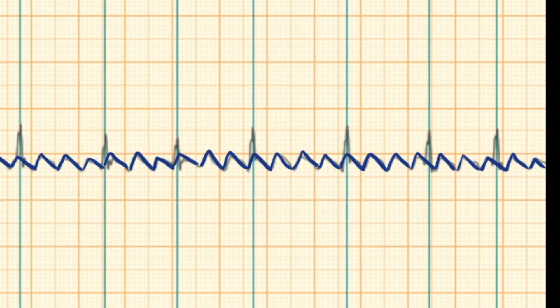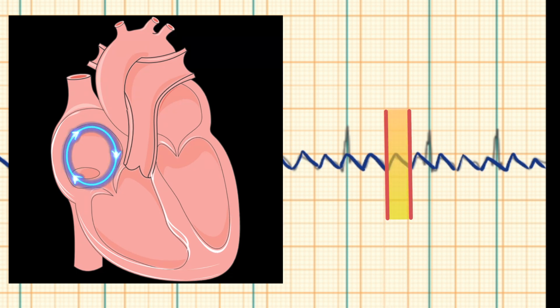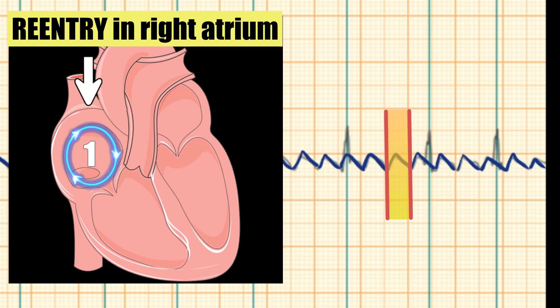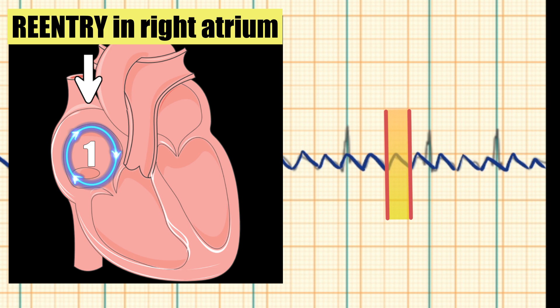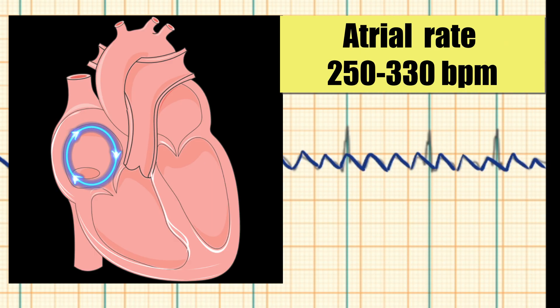Atrial flutter is a macro reentrant atrial tachycardia. Every sawtooth wave indicates one reentry circle inside the right atrium. Atrial activation rate in the case of atrial flutter ranges from 250 to 330 beats per minute. Let's calculate the rate of sawtooth waves in our case.